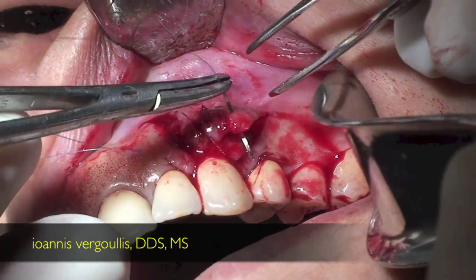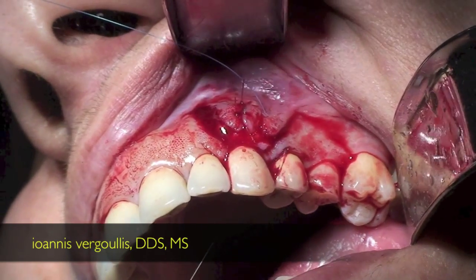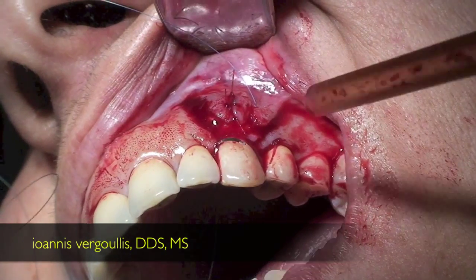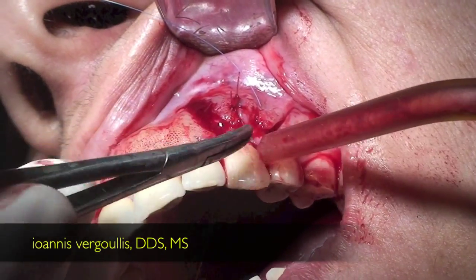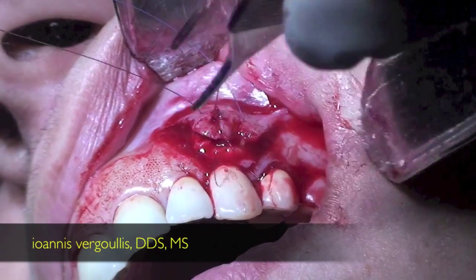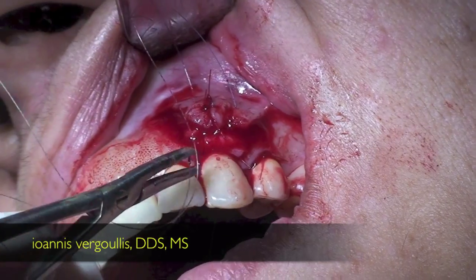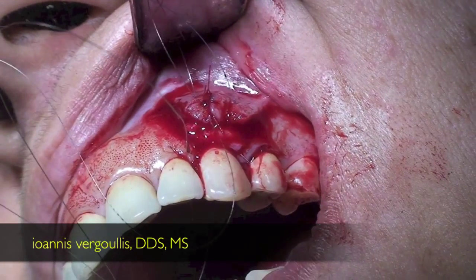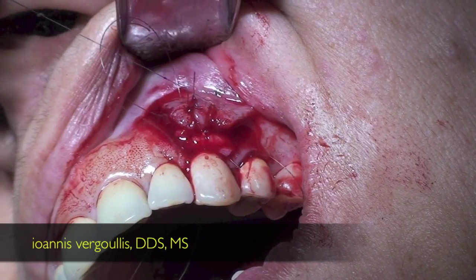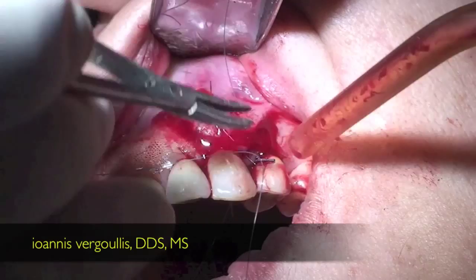Now we want to coronally position the flap, and one of the nicest suture techniques to achieve that is a sling suture. So we go from the flap around the tooth, inside the flap, and we come again back around the tooth. And this will allow the flap to be coronally positioned and completely cover our connective tissue graft.